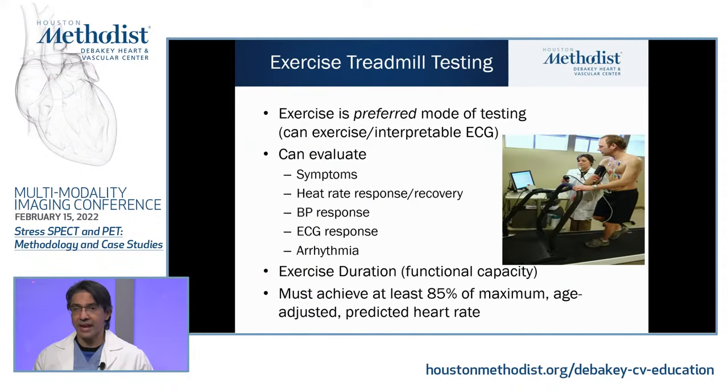So now that we understand how to exercise, one of the ways we exercise, our preferred mode of exercise, is treadmill testing. Now, why treadmill testing? Well, many reasons. You can get a lot of very valuable information, including a patient's symptoms. Really, that's when a lot of patients complain of symptoms. They can have heart rate issues. You can monitor their blood pressure. You can look at their EKG changes, and you can look for arrhythmias.